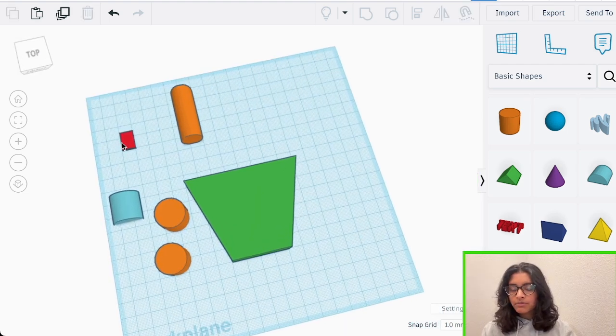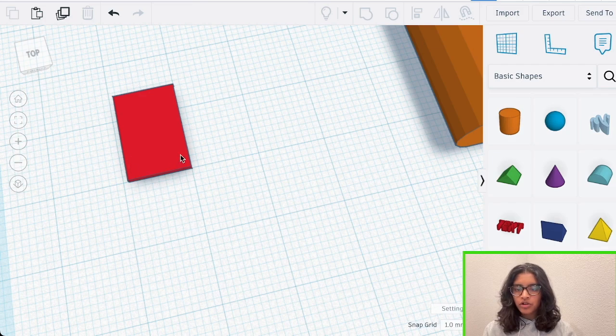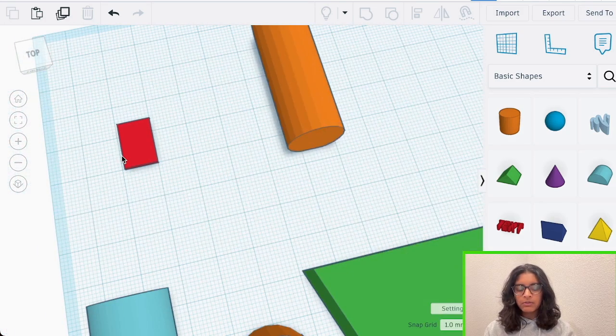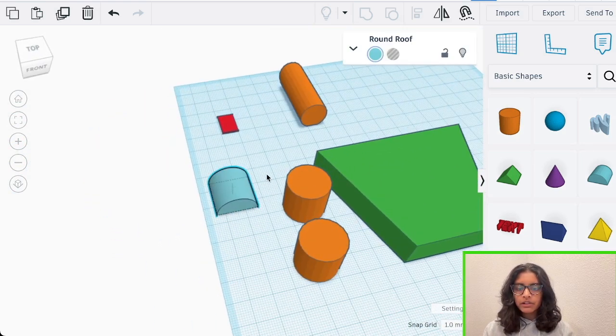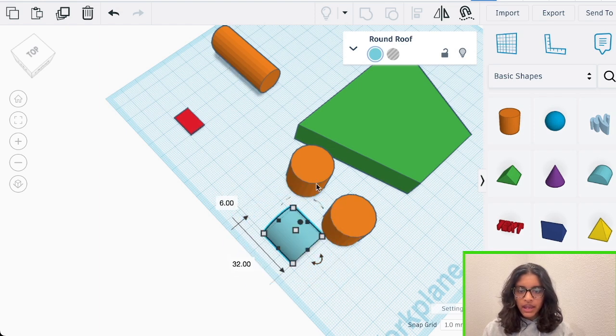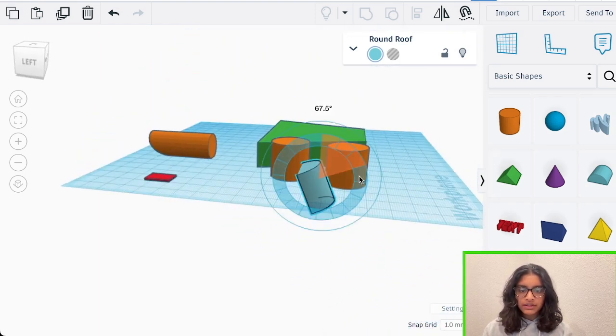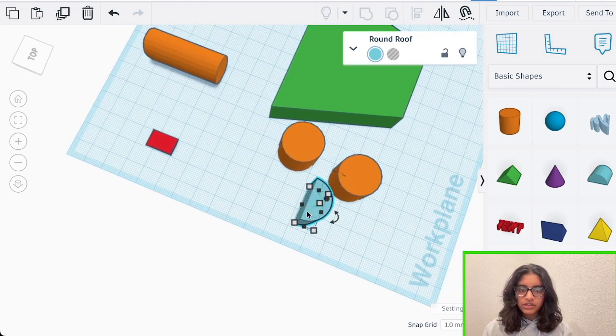Alright, so after making the base of our fingernail, all we're going to need to do is curve off these two edges of the fingernail and then provide a larger curve on the bottom of this fingernail to match the shapes that ours generally tend to have. The way we're going to do this is we're going to make that big bottom curve with this semicircular shape, and all we need to do is put it on the same orientation as the cylinder, and we're just going to carve out a curve into the cylinder.